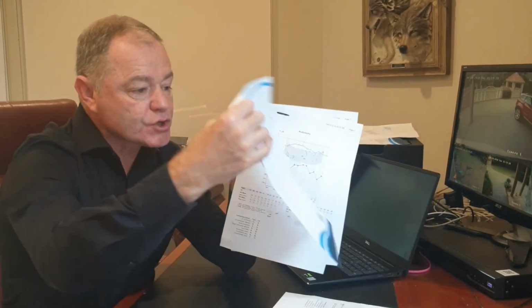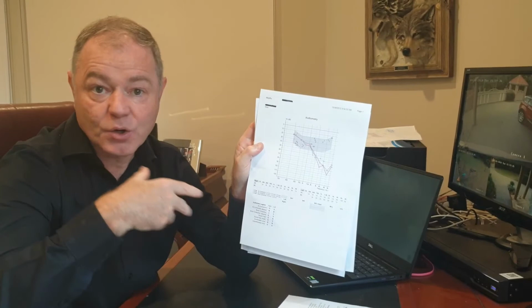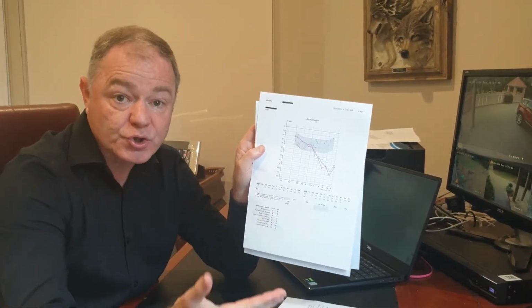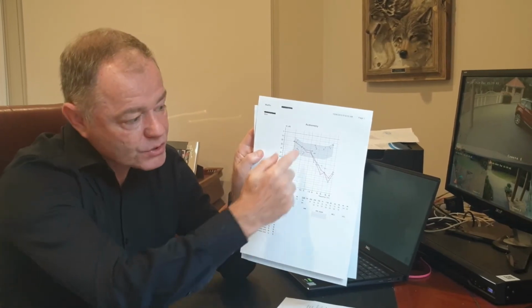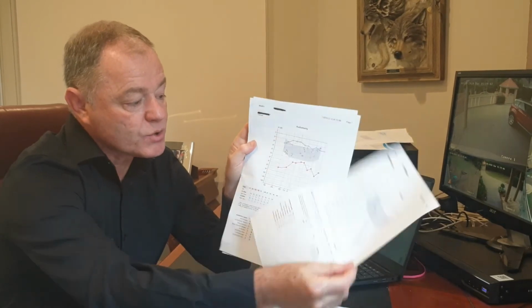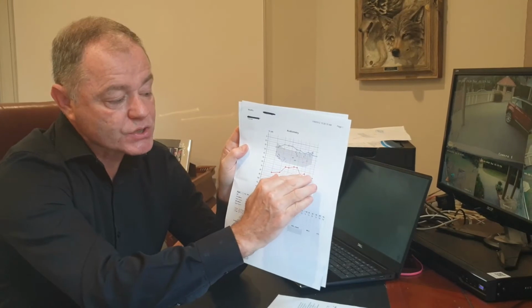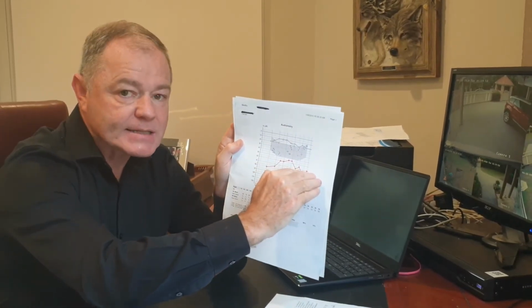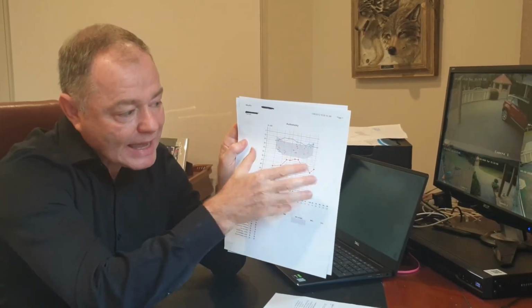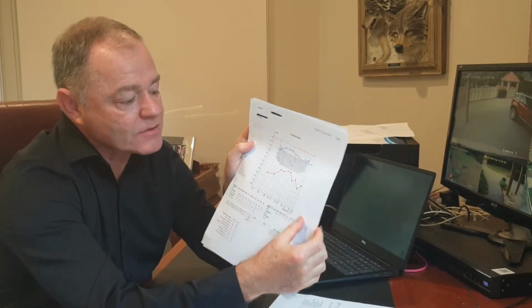But again, totally different loss, and you can see this type of loss is very flat, whereas the previous loss, when it's a noise-induced type hearing loss, which may be caused by farmers sitting on tractors with noisy exhausts, or people who've gone shooting or working in noisy factories, normally it'll be these high frequencies that are affected, and the lows are quite good. With most, not all, but with most conductive losses, we find they tend to be flat, and some of them actually taper upwards on those high frequencies. So again, a different pattern. So we get quite familiar with looking at these various patterns.